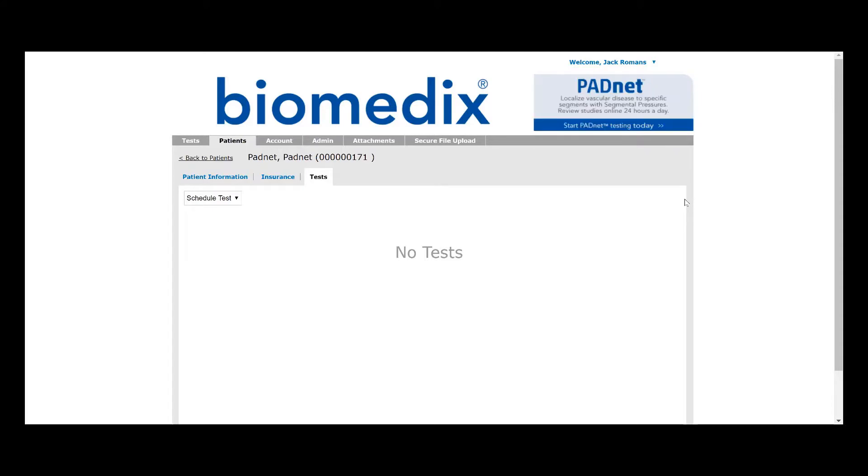To start, we will create our patient PadNet-PadNet the same way as we've created all other patients. From here, we'll go ahead and schedule an arterial study.